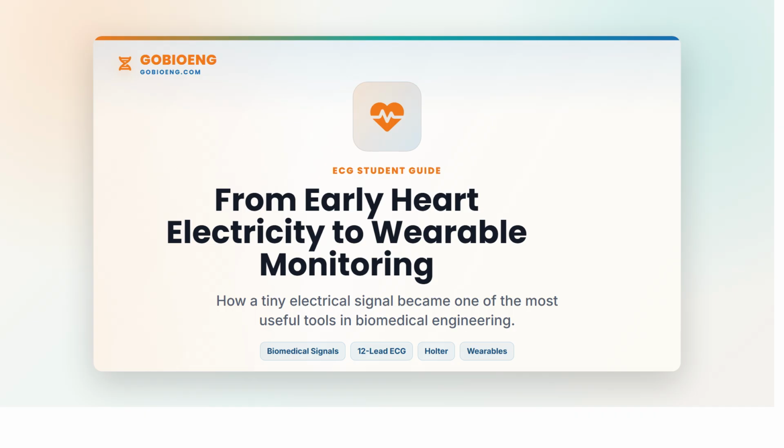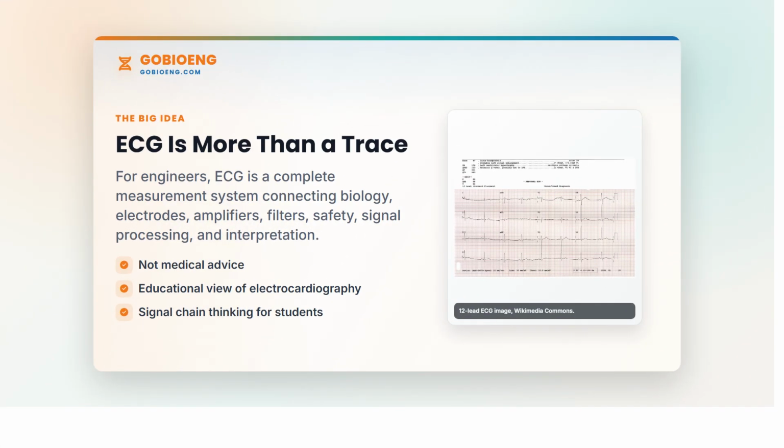Most people see an ECG as a line on paper or a waveform on a monitor. But for engineers, ECG is much more than a trace. It is a complete measurement system. It connects biology, electrodes, amplifiers, filters, safety, signal processing, user training, and clinical interpretation. An ECG does not show a picture of the heart. It records electrical activity detected at the body's surface. That small difference is important. The heart produces coordinated electrical events. The ECG system measures voltage differences created by those events, then turns them into a readable trace.